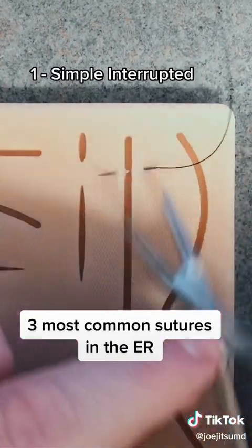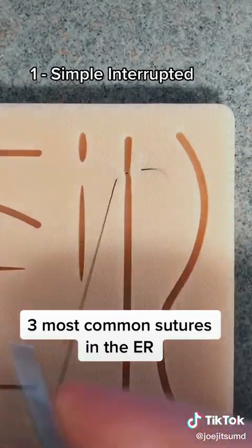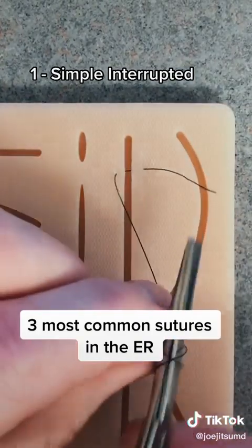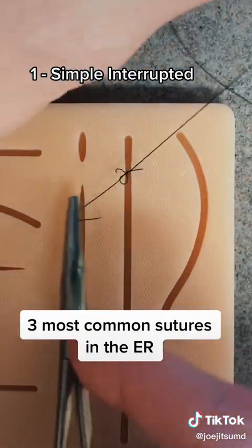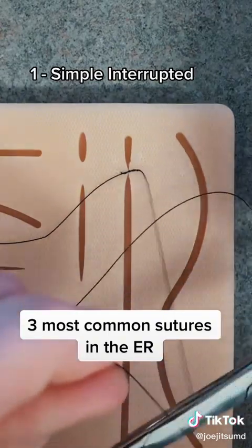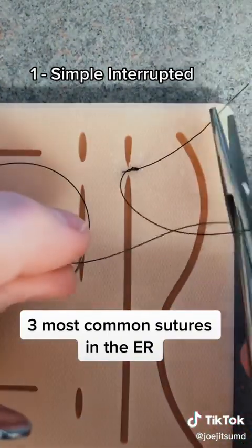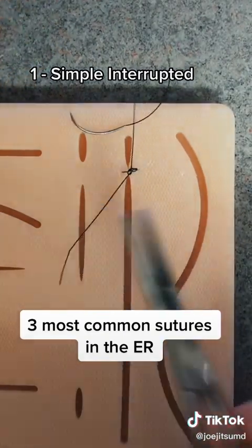The first type is the most common, a simple interrupted suture. As you can see, we pass it from one side to the other, wrap twice around the needle driver, and then close a loop. After that, we're going to apply several one-wrap knots on top for additional strength. This suture type is appropriate for most wounds we see in the emergency department.